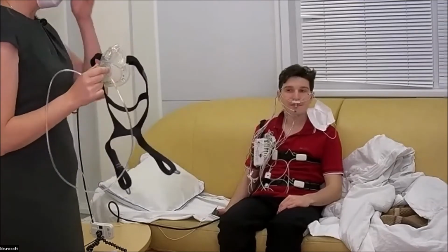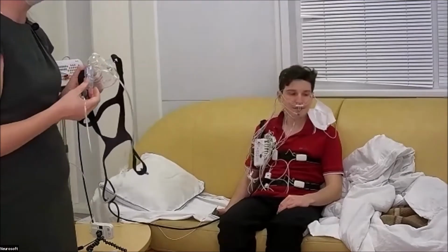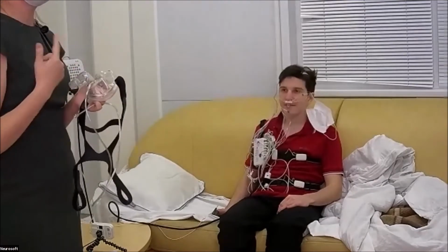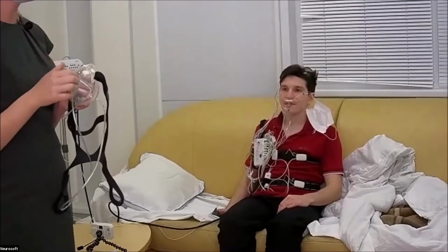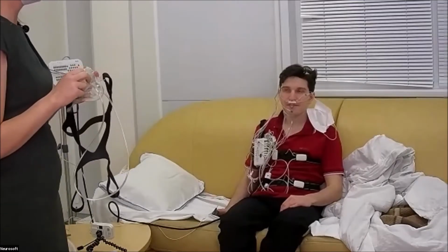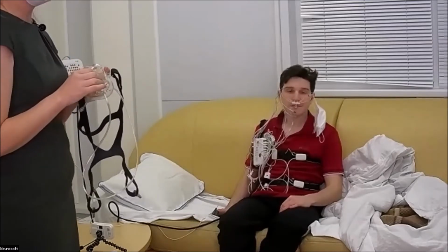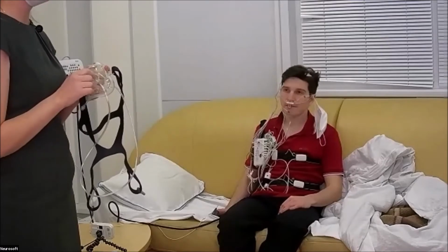In the majority of cases, I think almost always, we take out the thermistor sensors too, but sometimes we can skip it. So we can perform the test with the thermistor sensor under the mask.